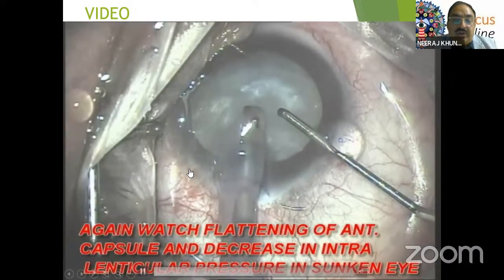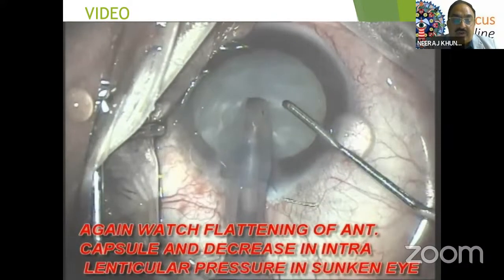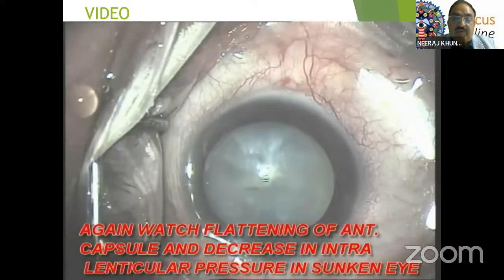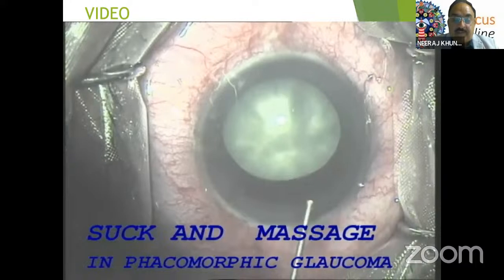Now there is another clip for the same. Again, see that there is a sudden flattening once we go to position 3. We directly go from 0 to position 3.